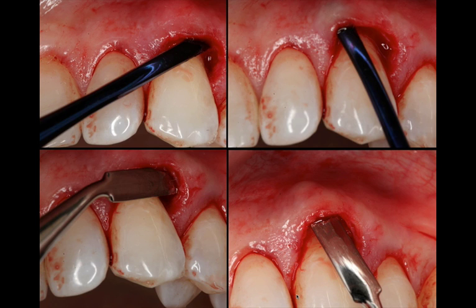Now, in a tunneling approach, we are working in a full thickness. The reason being, we would like to maximize the tissue thickness because one of the risks of tunneling procedures is a perforation, which can obviously cause failures and problems. So we're working in full thickness.